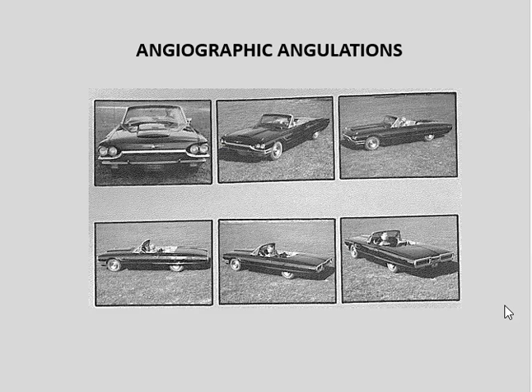When we view the heart from X-ray images at different angles, it's an analogy to looking at a car from different angles. The first picture on the left shows the car end on. Imagine looking at the heart end on from apex to base, as opposed to looking at the heart or the car in profile. You'll get totally different images. And then you have different angles looked at from the sides and in the heart from above and below, anteriorly and posteriorly as well. It's our job to build up a three-dimensional image of the heart from images comparable to these of this car.